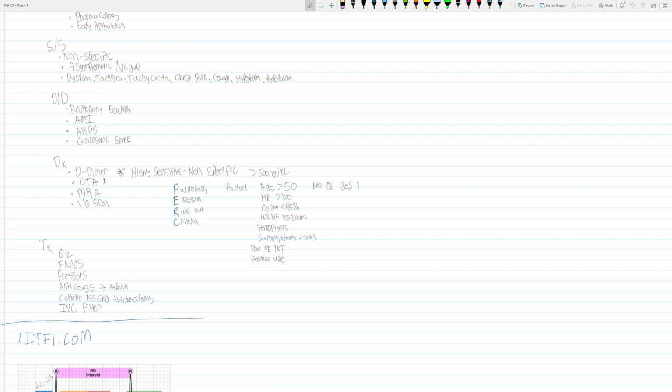This has to do with the timing of the contrast being injected, which needs to be timed correctly for the scan to pick it up within the heart and lungs. It's very specific, very timed. So make sure we have a large bore IV. Check the patient for allergies to contrast, and also rule out that they're not pregnant.